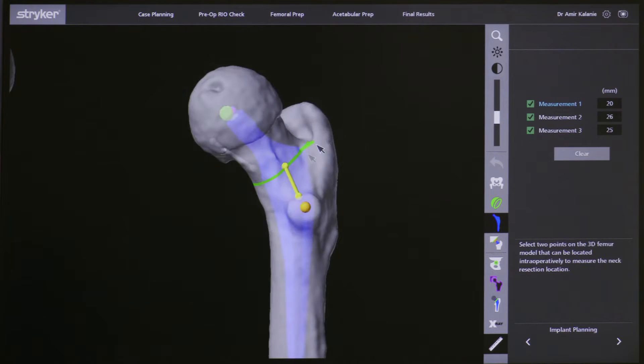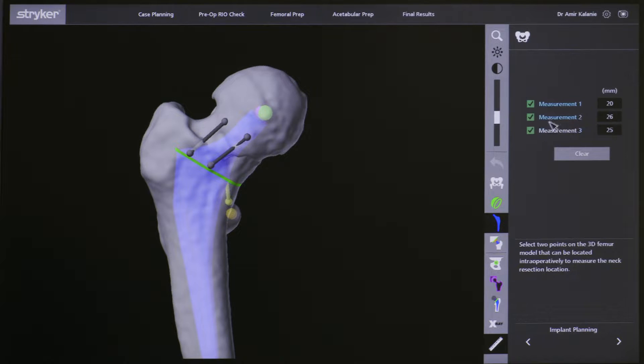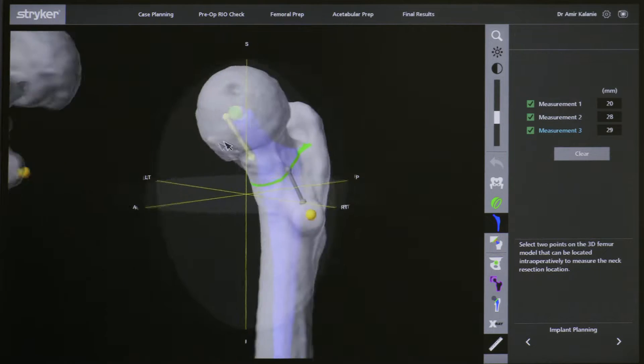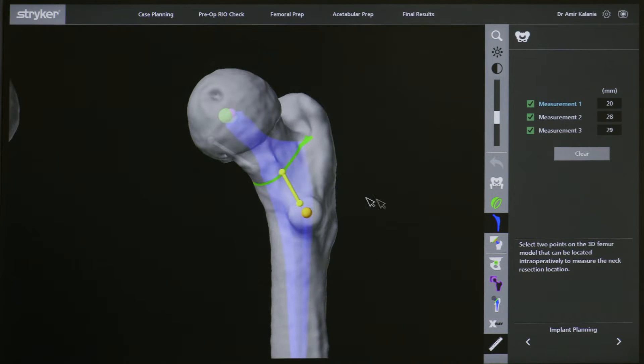Here I make measurements in terms of where I need to cut the femoral neck during the operation. I take certain anatomic landmarks, make digital measurements, and then use these measurements intraoperatively to ensure that the neck is cut at the appropriate level, which reduces the risk of errors in restoring leg length. If the stem is placed exactly where planned, getting the leg length wrong is highly unlikely.